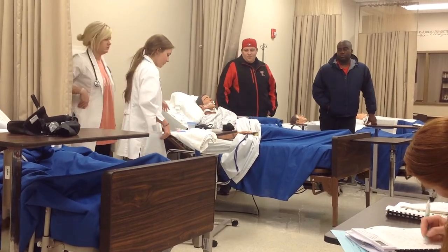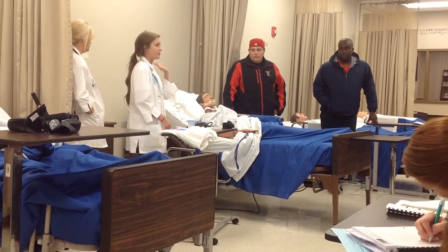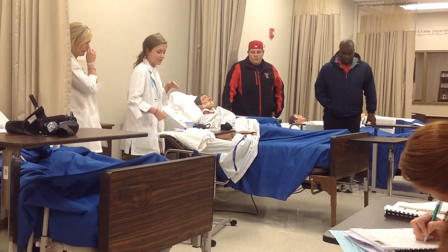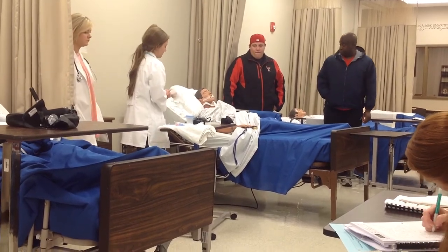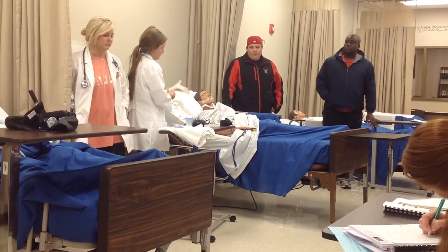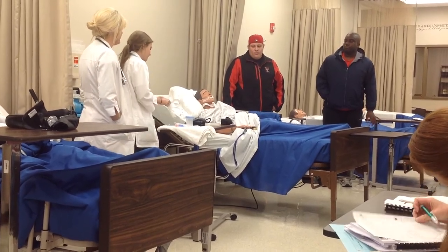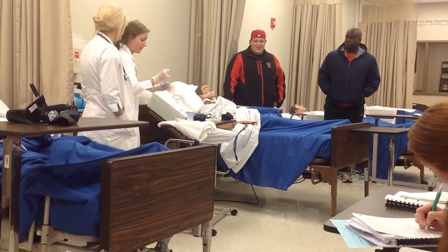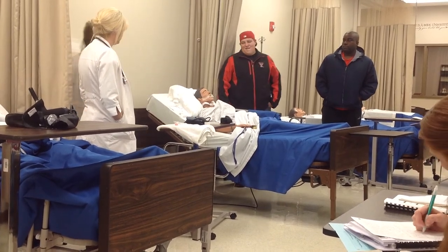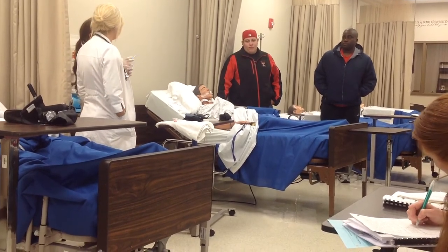So after you put that in, there's a good chance they're going to have some secretions back there, and you're going to need to do some suctioning. So wash your hands, put on some gloves. For the suctioning, you're going to have a Yankauer tip, a specimen cup, and then your canister. Before you do it, you need to fill the specimen cup with 100 mL of water.